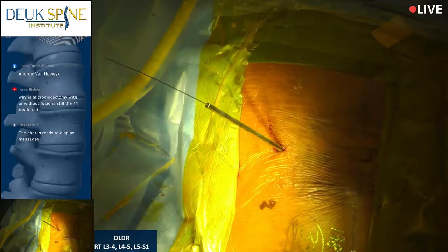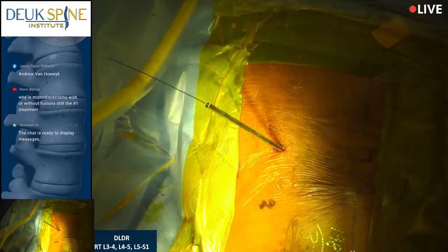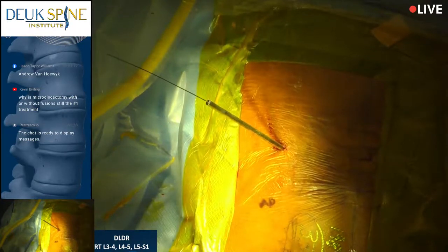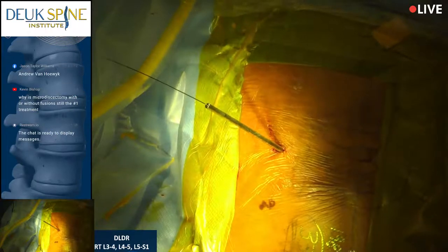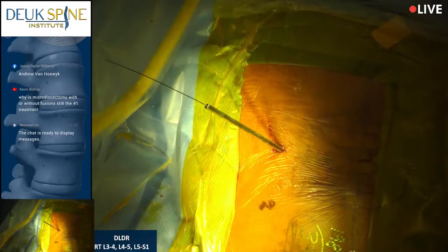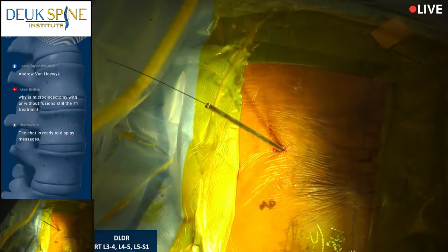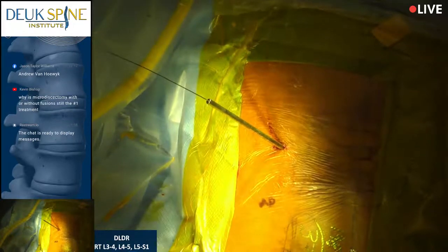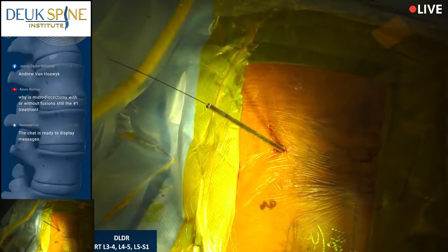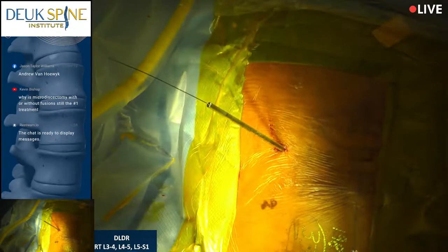And welcome back. We're still trying to get our picture right with the fluoro. Monica, you don't see the pedicle of the bone at L3, how off they are. Stop holding the button down while you're moving the fluoro. That's why you get a blurry image. You have to stop the machine from moving and then push the button.